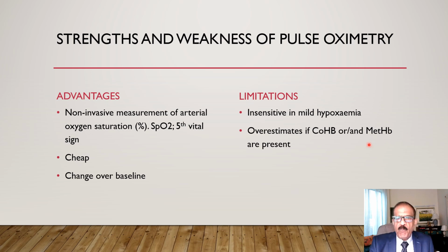situations. Both methemoglobin and carboxyhemoglobin have the same pattern of absorption and emission of these wavelengths. So this device will read carbon monoxide-bound hemoglobin and methemoglobin as oxygenated hemoglobin. So you have to rule out these situations. It could be deceptive if there is any of these two.